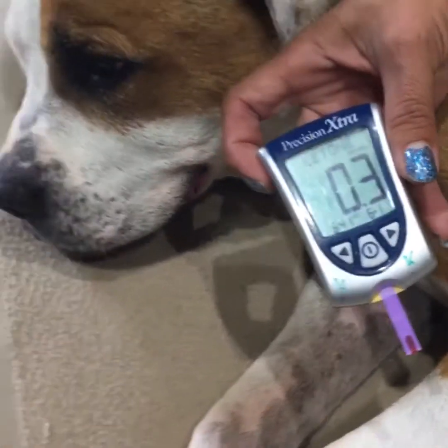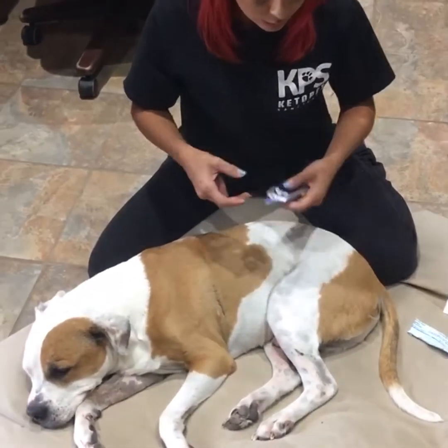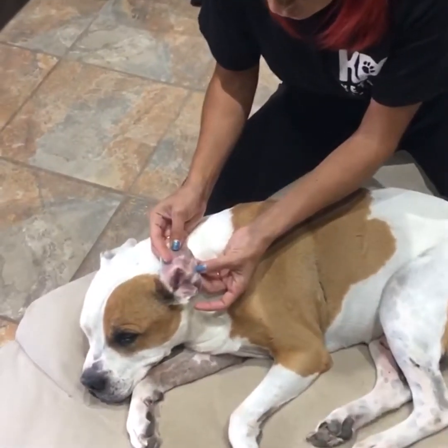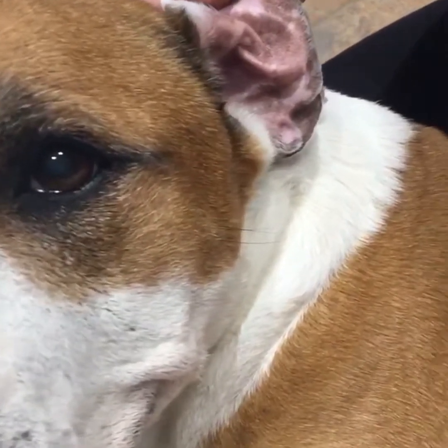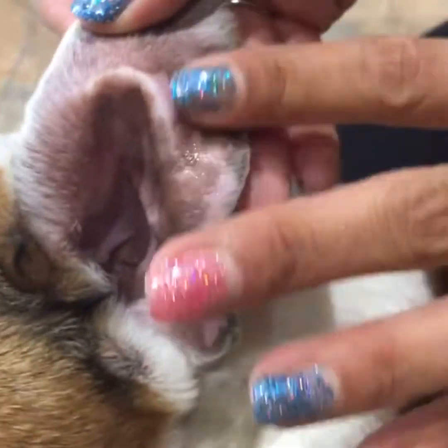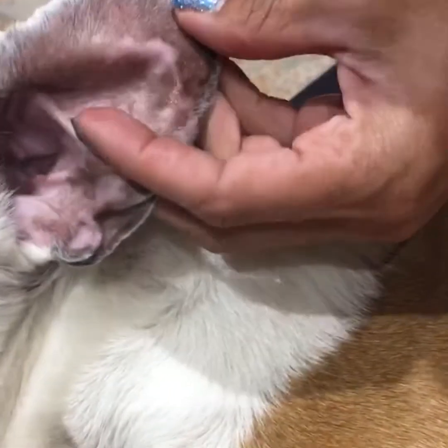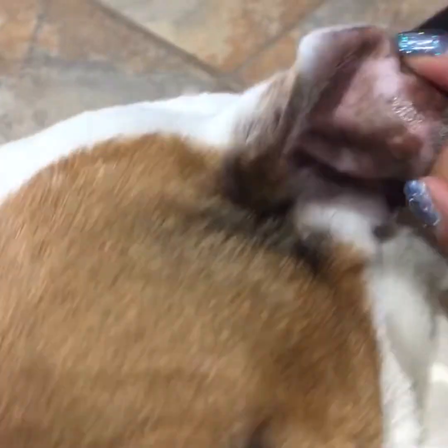Another spot you can use is the ear, though I'm not a huge fan because it doesn't bleed very much. A lot of dogs like Pomeranians or long-haired Chihuahuas have a lot of hair in the ear. A trick I've learned as a vet tech is to use a little antibiotic ointment — just rub a little bit on the ear. That way when you poke it, the blood will puddle on top of the ointment instead of soaking into the hair.